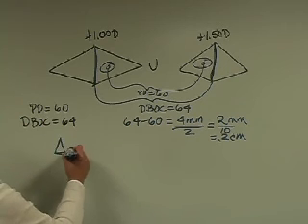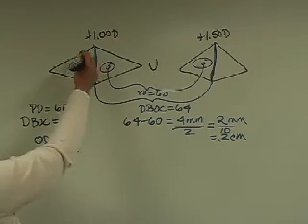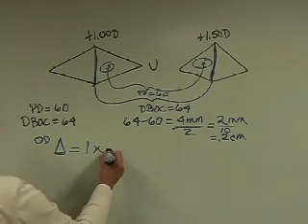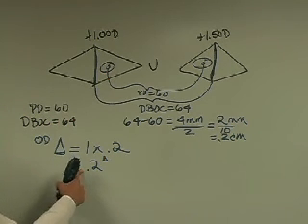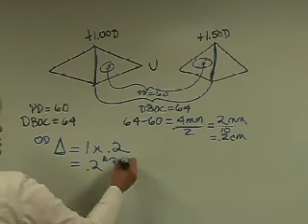So we have Prentice's rule. We'll do this for the right eye. The diopter power at 180 is 1 in this case, times the distance off the optical center in centimeters. So you have 0.2 prism diopters. Remember, prism doesn't have a sign, but it always has a base direction, so base out.